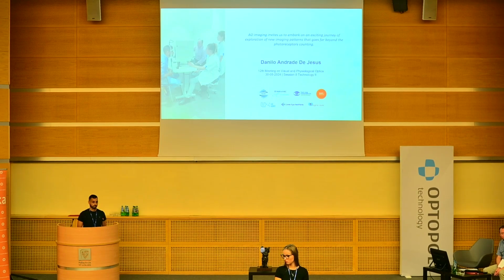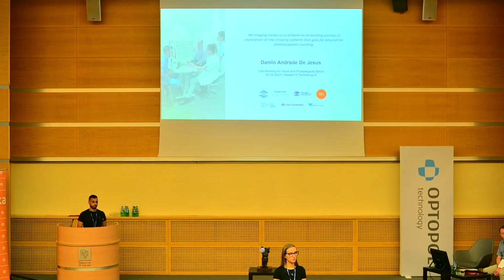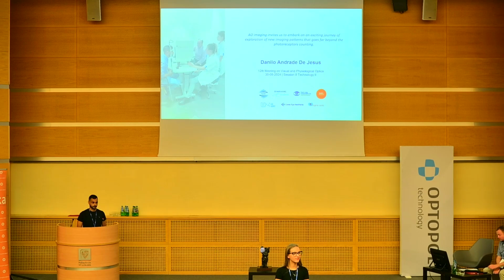The pathologies usually are age-related, but also cataract is age-related. So you cannot analyze the state of the retina in this way when you have, for example, a 60-year-old patient. Okay, so it's always a question how to use it to have a very good technique. But it's of course very interesting, it's worth developing, but could you comment on this problem of scattering light in the intraocular lens that makes the images much worse?